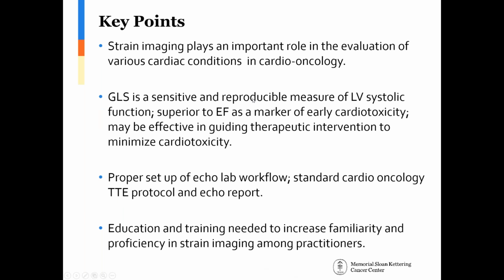So in summary, strain imaging plays an important role in the evaluation of various cardiac conditions in cardio-oncology. It is a sensitive and reproducible measure of LV systolic function, superior to ejection fraction as a marker of early cardiotoxicity, and may be effective in guiding therapeutic intervention to minimize cardiotoxicity. It is important to have proper setup of echo lab workflow, a standard cardio-oncology TTE protocol, and echo report.